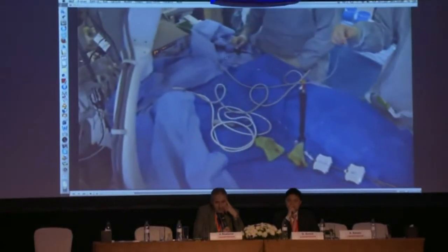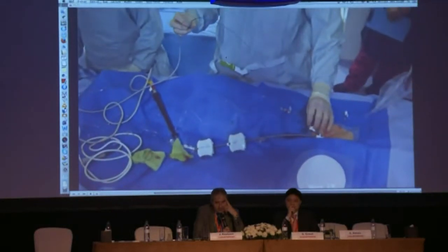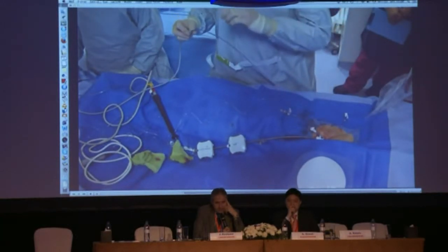We're then putting our decapolar catheter up. You can see me manipulating it there. And what we're really going to be seeing is the CARTO view. So if we can just skip forward a bit. Now, please, Fred, skip forward to the CARTO when we're recording the CARTO images.